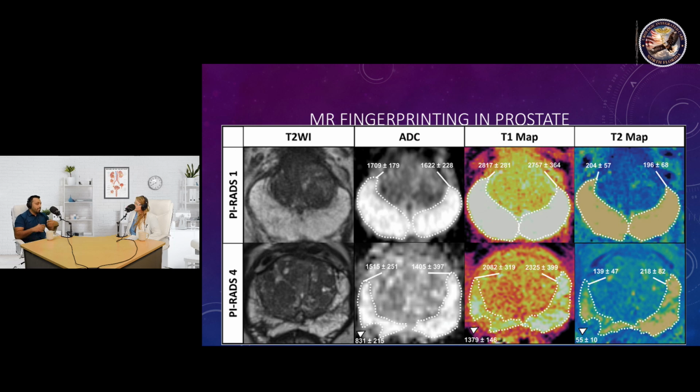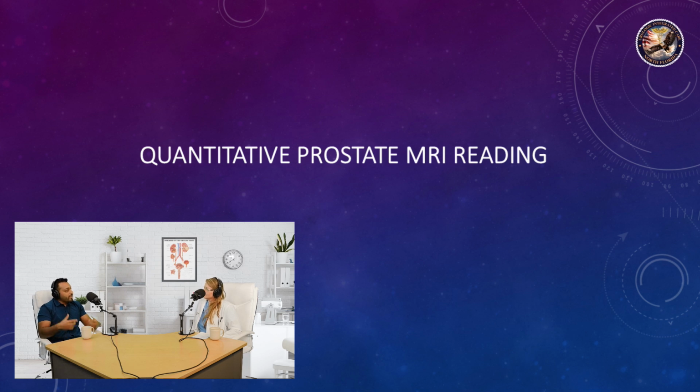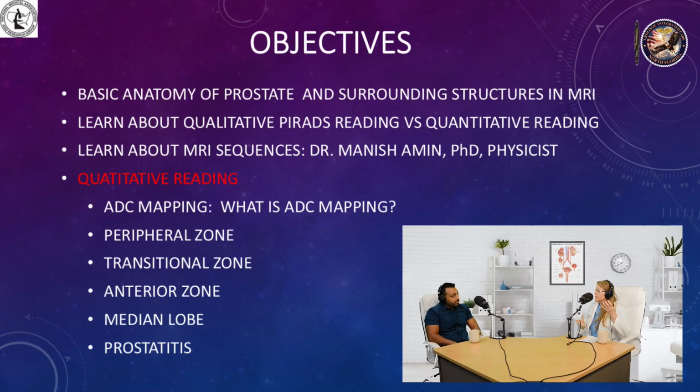These are just quantitative numbers that we can then hopefully feed into an AI model that makes it even quicker and easier for urologists to pop up an MRI scan, see where there is something they're worried about, and then correlate that with potential cancer. That's wonderful. The goal is being able to do things efficiently, but also very accurately. Especially with the physician workforce shrinking and the advent of AI that's going to help us figure out all of these features, so we can be more efficient, but also accurate, so we don't compromise that.